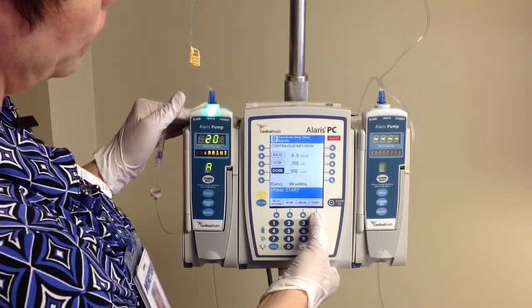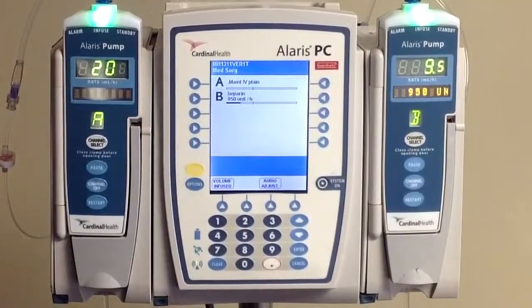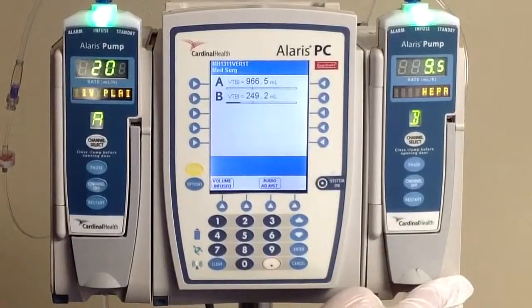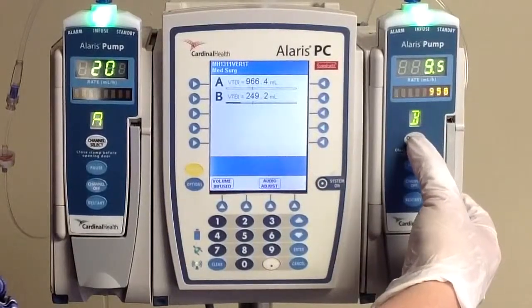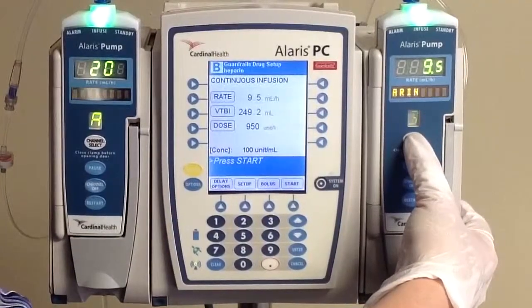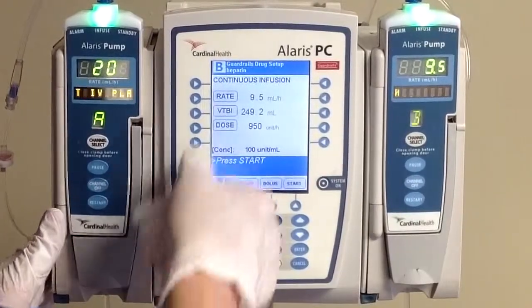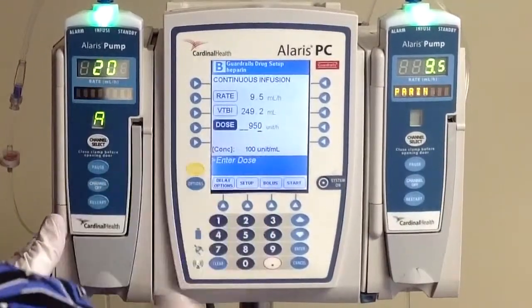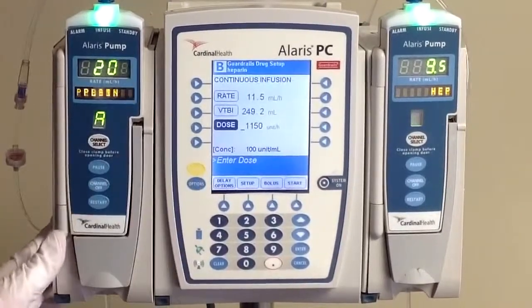Go ahead and hit start on your pump at this point. Based on our scenario, we have to change our rate based on the heparin level result of 0.12, which means we're going to have to increase our rate to 1,150 — increased by 200 units basically — and we're going to give a 3,000 unit bolus. Start by talking to our module, click the channel select, and we're going to start by changing our rate. Increasing by 200 units is going to put us at 1,150, and using our smart pump, it's going to calculate our rate for us.